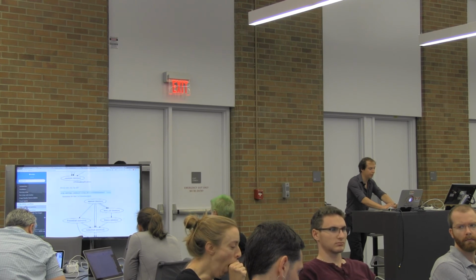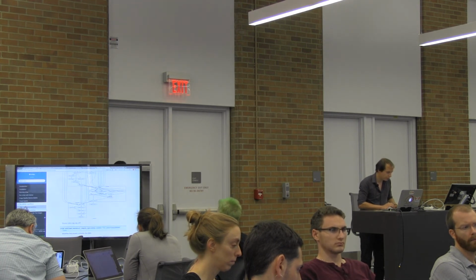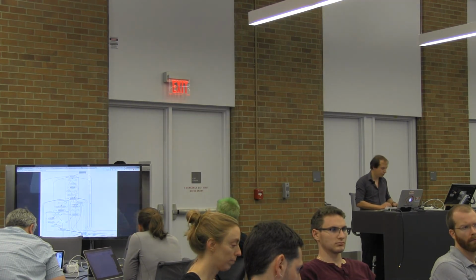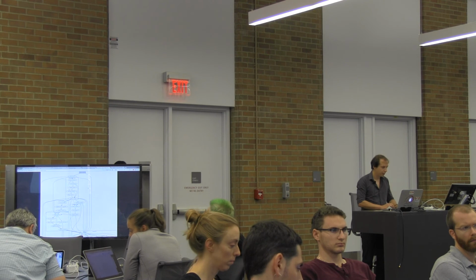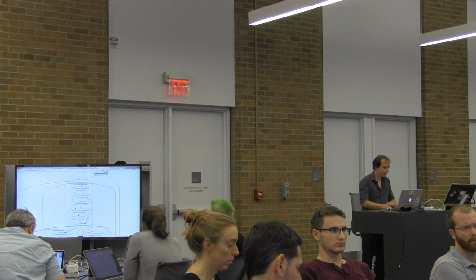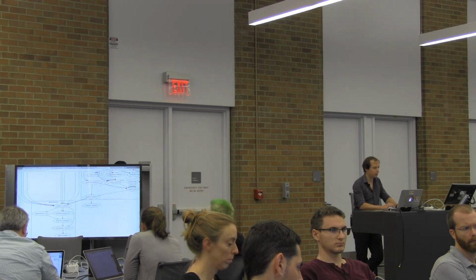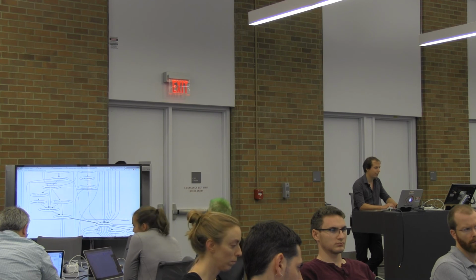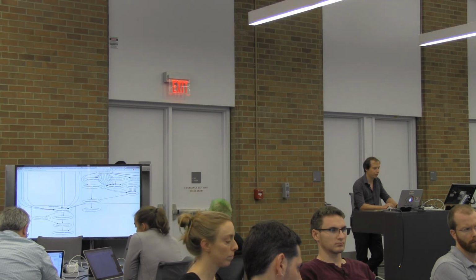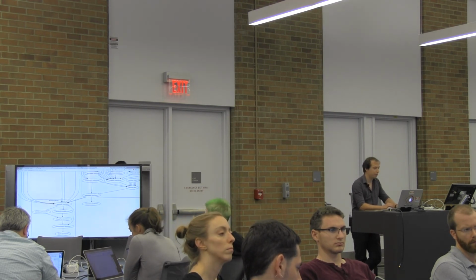So to do this, Oscar has developed a workflow, and this workflow might seem a little bit overwhelming to begin with, but if you look at it, it actually is built from those blocks here. You see this ANTs skull strip workflow, spatial normalization workflow, and there's a head mask workflow, and an air mask workflow, etc., and computation of IQMs, which are the quality metrics, and then reports.